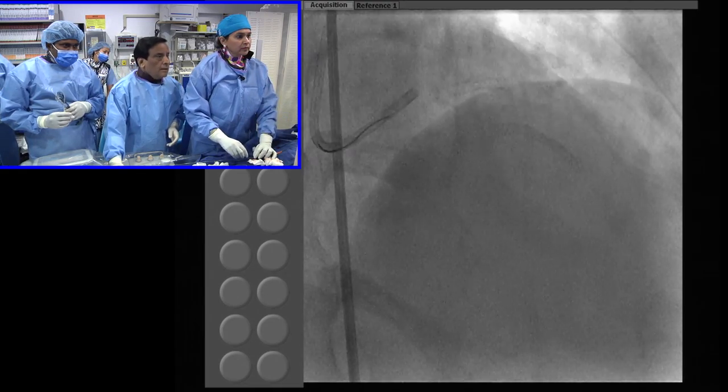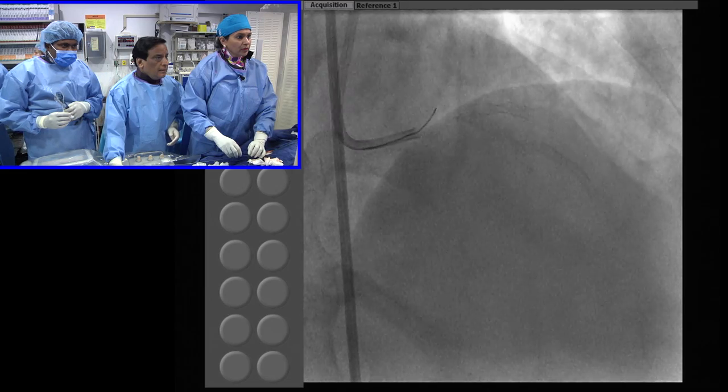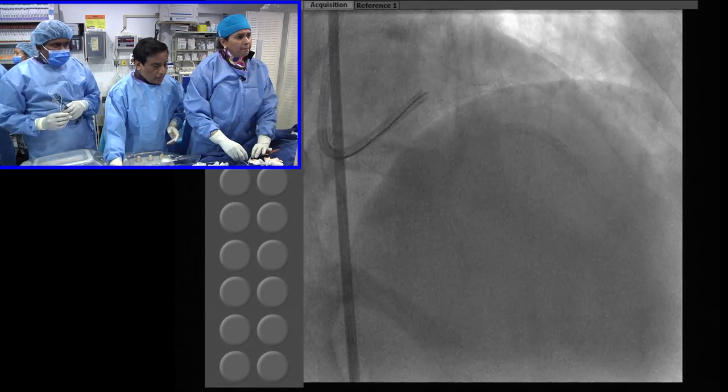Anu, why had you removed the wire? It just came out. Need a new run through. Yes, it's a VL30.